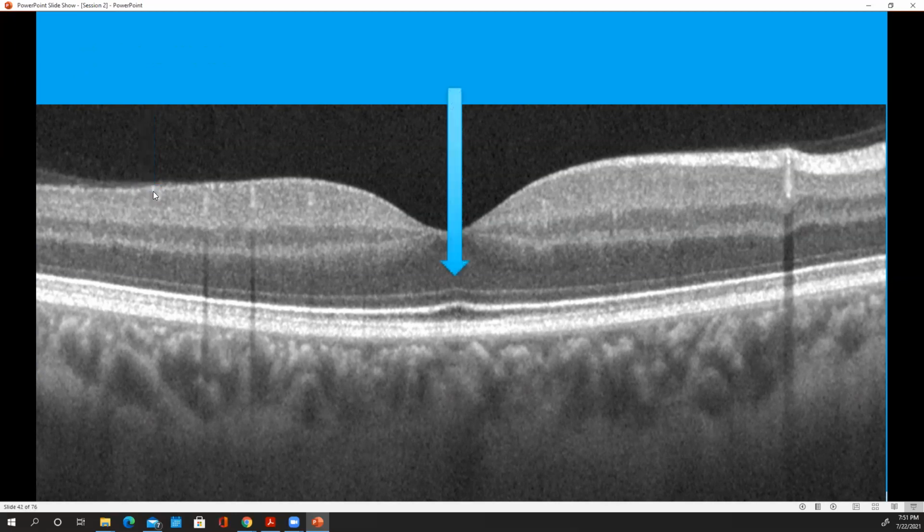Okay. How about that guy? That's the outer nuclear layer. Outer nuclear layer. You got it. How about that guy? That's the nerve fiber layer. Nerve fiber layer. How about this guy? Inner plexiform layer. Got it. How about that layer? Outer plexiform layer. Got it. How about that? What is he? Vitreous. Right. Vitreous is always dark. That's what all of this is kind of based on.